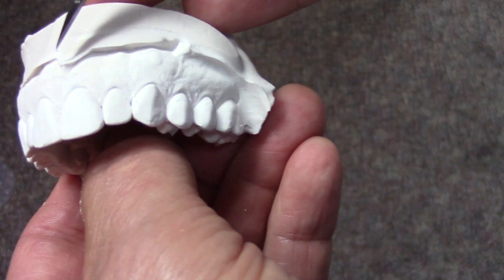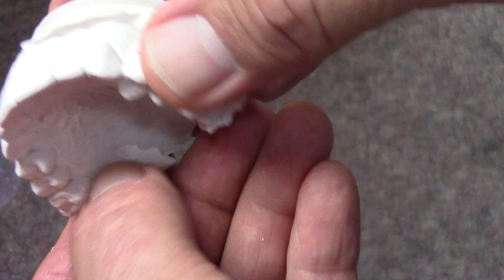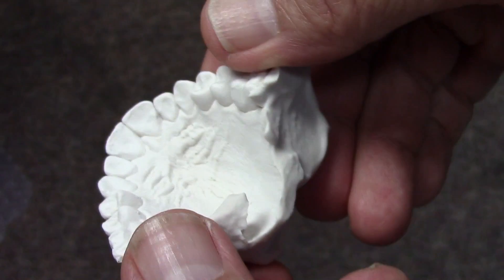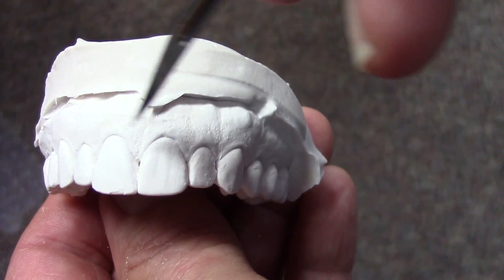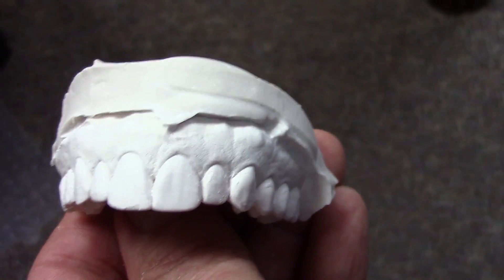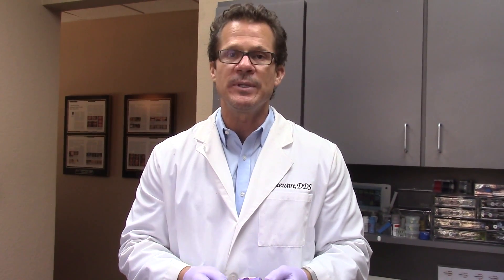Remember, the first model is always the very best one. The second, third, and fourth pour can be used for various things, but for your final diagnostic wax-up, use the very first model. That is our technique for taking a polyvinyl impression that gives you accurate results on a consistent basis. It's very easy on the patient — no gag reflex issues with this whatsoever. We really like this technique. Hope you enjoyed this today.